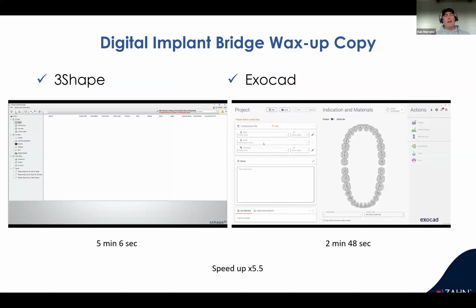Yeah. And as I talk to a lot of colleagues and we look at crown and bridge design and stuff like that, we spend a lot of our time now in kind of data management, and alignments are kind of an unappreciated aspect that can really hurt your business by spending too much time. Or if it's misaligned, then it's causing a possible remake. So pretty much since I figured out how to integrate in and out of 3Shape and exocad, I've used exocad for all the alignments, especially the surgery alignments.